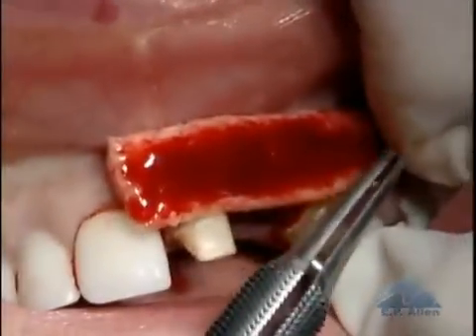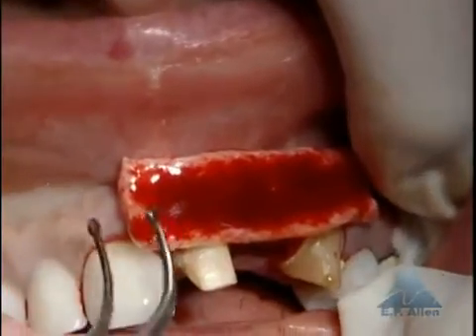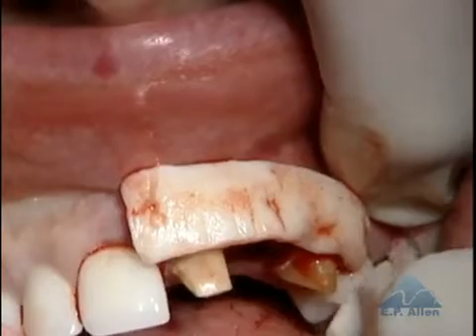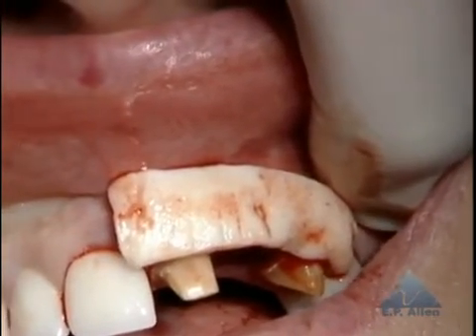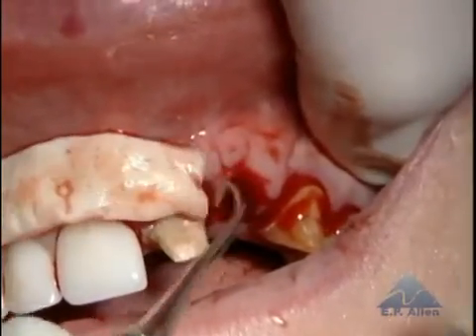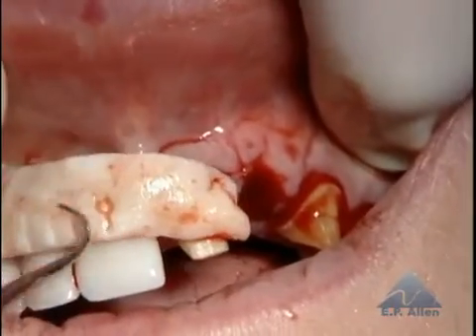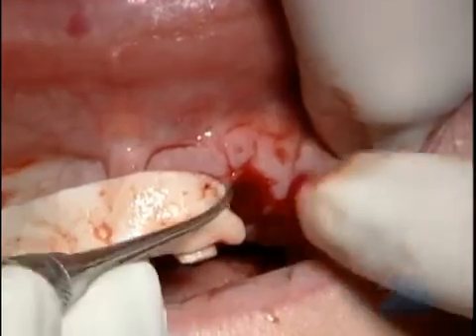We'll check the length, and it looks like we're about right by the time we take up a little bit of the size in the middle portion. This actually will be placed so that it is basement membrane side facing up, and we will introduce it through the sulcus. So we'll look at the entry area, and I will make the entry through the sulcus of the central incisor.